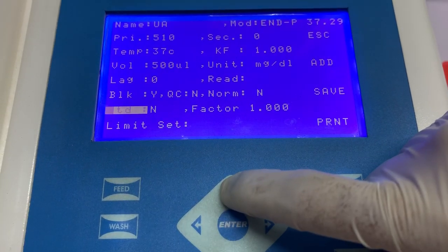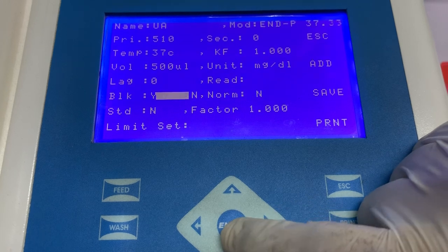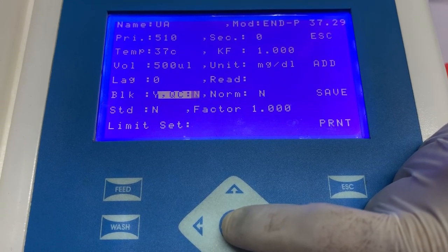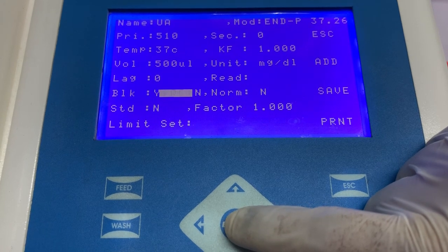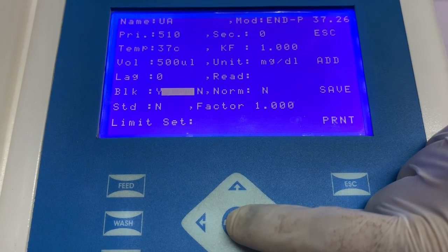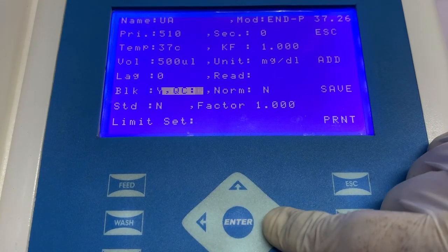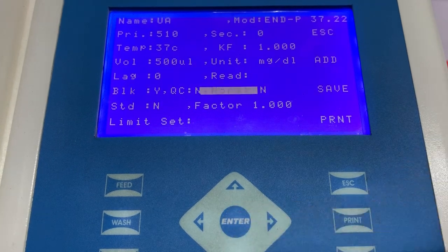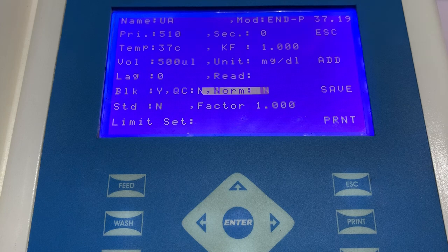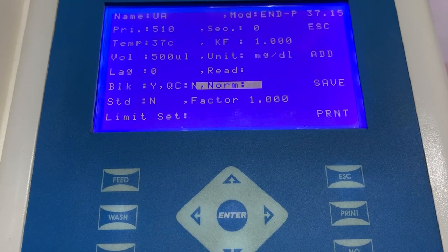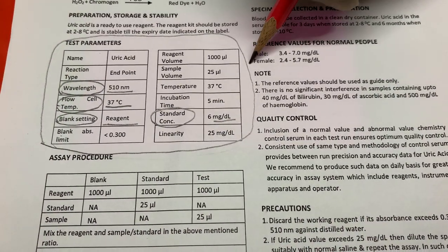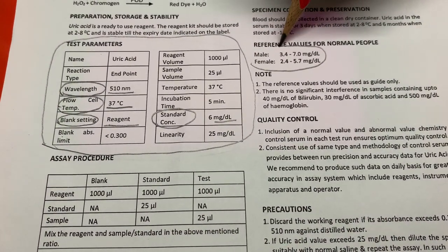The next information that needs to be entered is QC. If you are running any quality control serum, the value of normal or abnormal range can be entered here. The next information to be entered is the normal range of the patient sample. The laboratory should ascertain its own normal range, but if the laboratory has not established its normal range, the values mentioned in the instructions for use can be entered here.